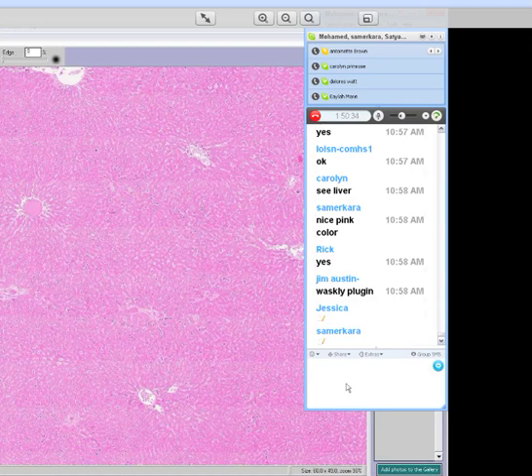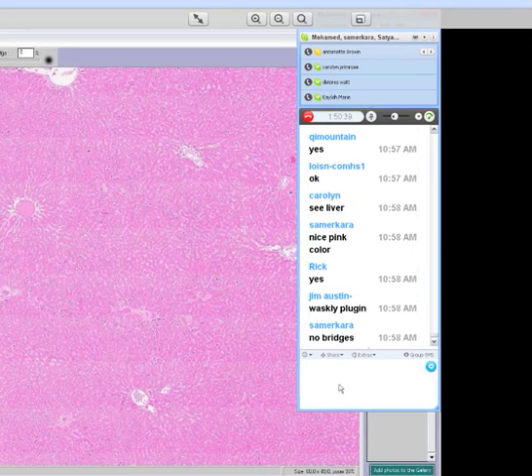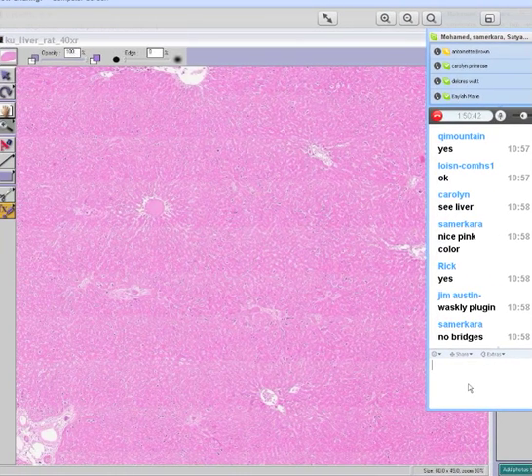This is our last case for today. Look at the liver. I want you to write something down. This is so important. I'm going to tell you what the algorithm is for liver. You ready? It's nice and pink. In fact, it's probably too pink. But do you see this central vein here? You can see that there's a little bit of congestion in it, but there's no connective tissue around it. So you know it has to be a central vein.